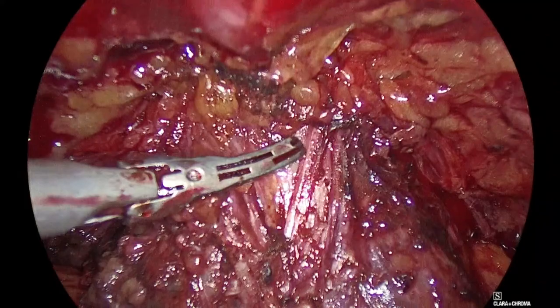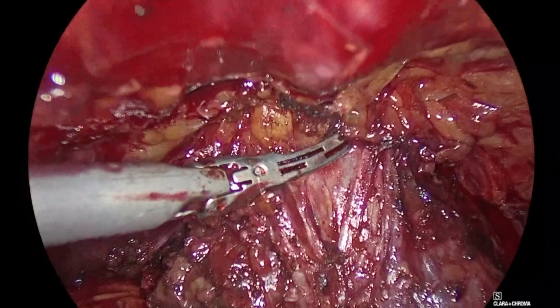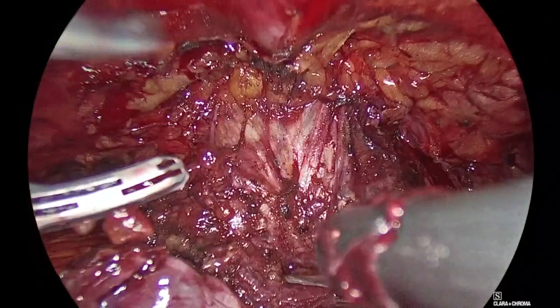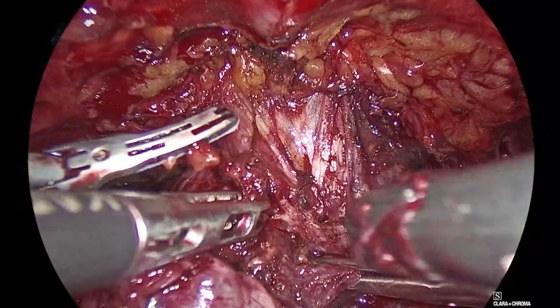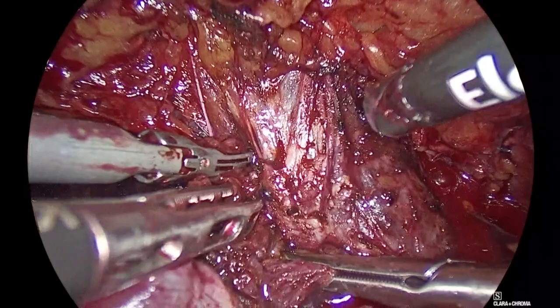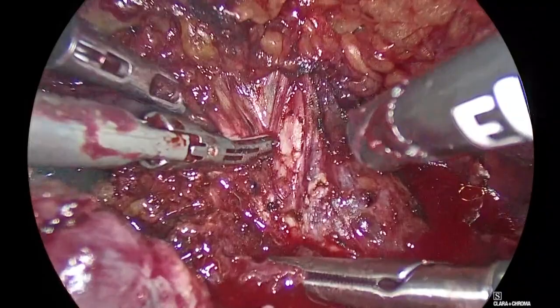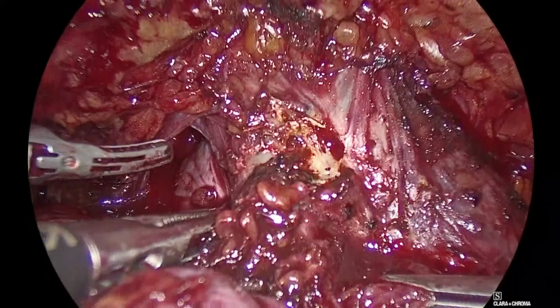Gas up. Not there. No, not out. Up. Yes. Good. Stop. Okay, it's nice to increase the gas a bit when you are at this level here to decrease bleeding. Okay, so look, I will cut. Here is the sphincter. So I'm slowly starting. Panayotis is pulling, and I'm slowly starting to dissect this part. Aspirate, Panayotis, on the right. Good. Slowly, gradually. You see how our level is here? Good. Come this side.